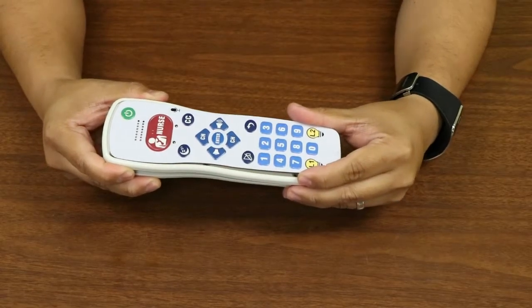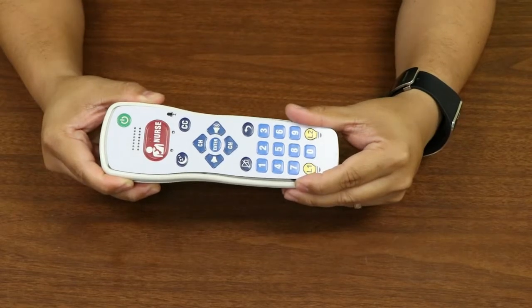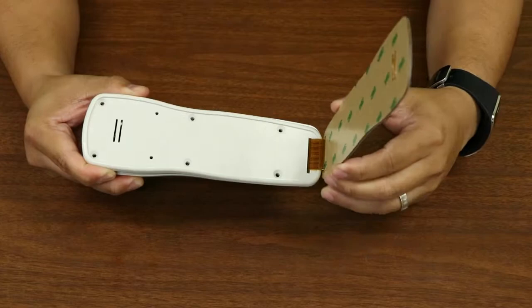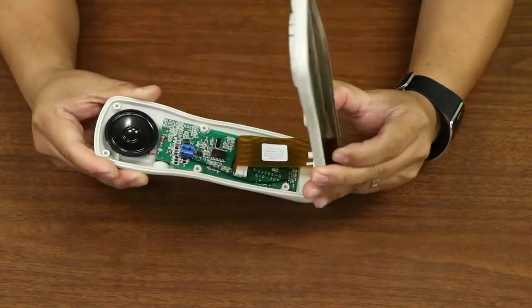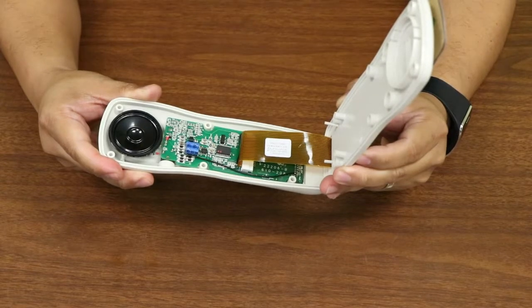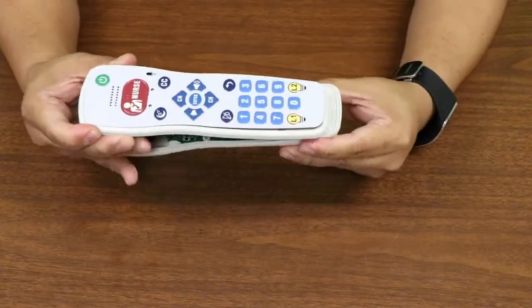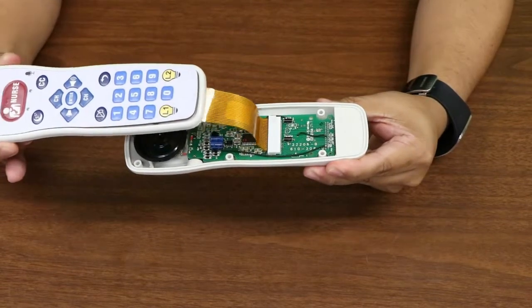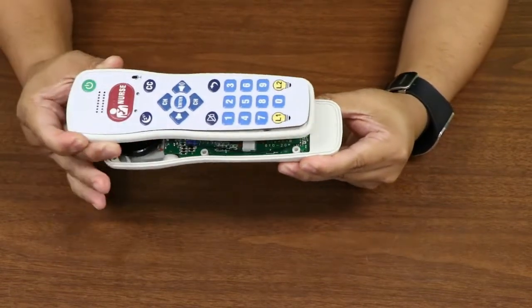A unique feature of this pillow speaker is its keypad. As you can see, it is attached to the top of a dual level case. The case is put together with a tongue and groove seal to eliminate fluid intrusion and protect the PC board. Notice that our keypad is attached to the printed circuit board with a ribbon cable.